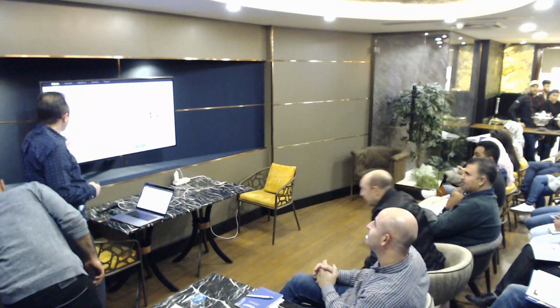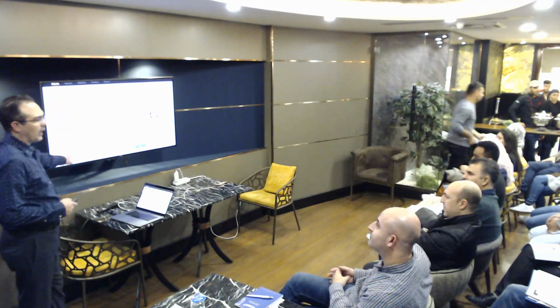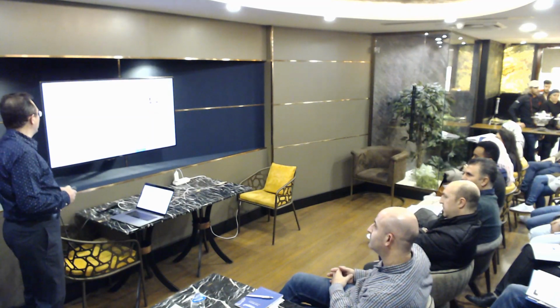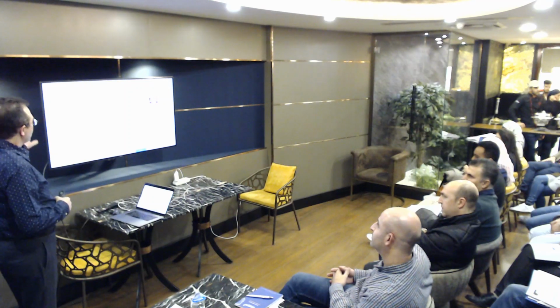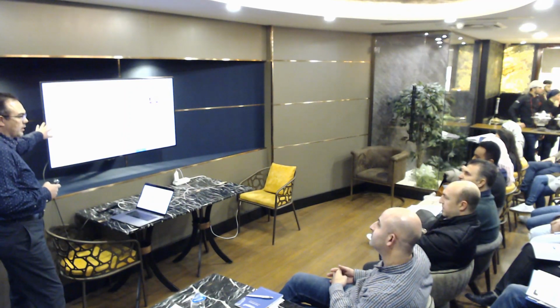السؤال التاسع هو بيسألك عن الكروس بايت، إذا كان في بوستيريور كروس بايت، هلا باي ديفولت هو بيحطها إنه دونت كوريكت، ما بيحاول يصلحها باي ديفولت، إلا إذا اخترت إنك تصلحها. هاي الصفحة اللي تحط أو this page is how to deal with the crowding and the spacing.